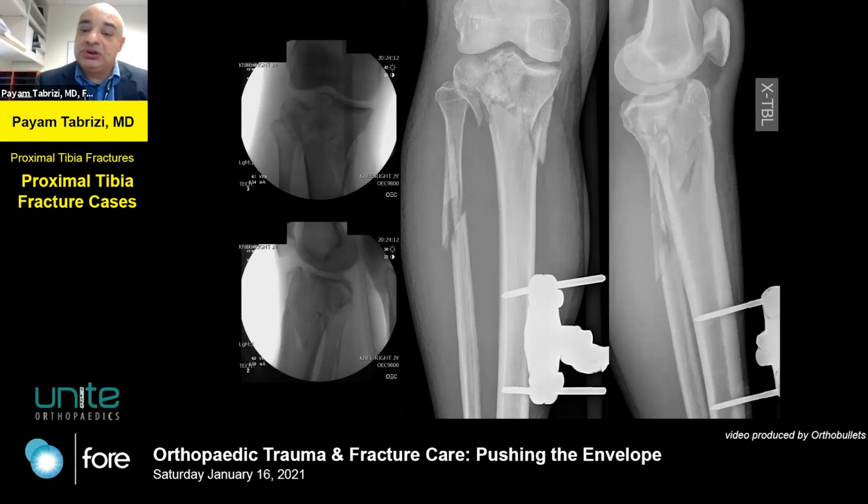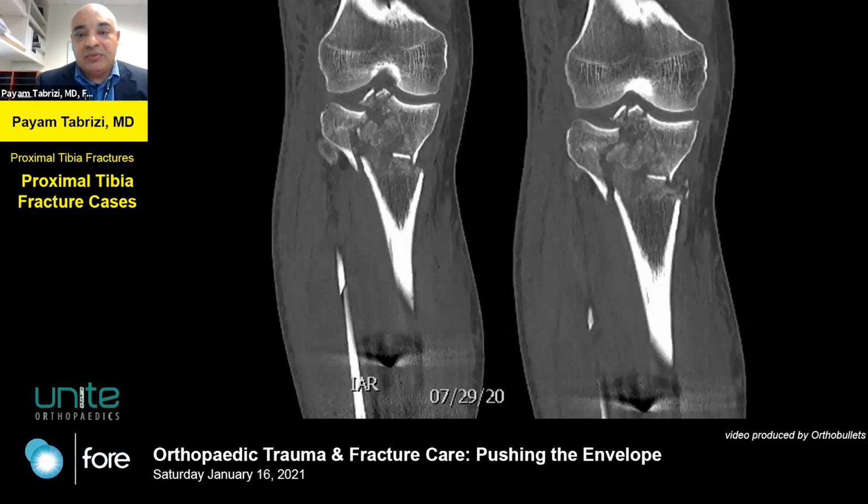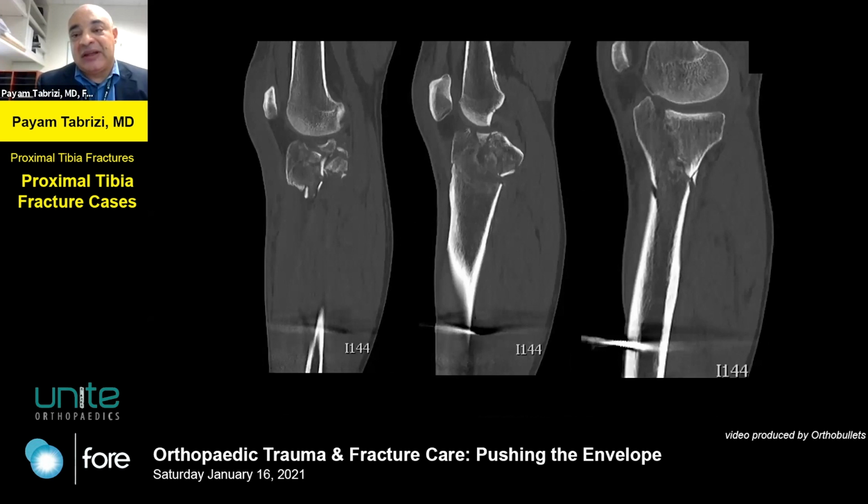There's the lateral view showing that the fracture seems to be out to length in the metadiaphyseal area. And again, I use the fibula as a judge. If the fibula looks like it's length stable, then probably the tibia is as well. So here's our CT scan, which shows a very comminuted fracture. Coronal views show that it's bicondylar, there's central comminution. I specifically look at the lateral. I'm looking for a coronal shear fragment, and seeing if it's out to length. This helps me with my approach and also where my fixation needs to be.